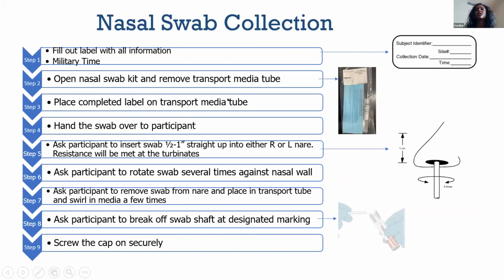Okay, the nasal swab collection. The participant will be collecting this themselves, so you're just giving them instructions on how to do this. First, these are the kits that are provided by ARUP, with the tube inside that has a little bit of media, and there's a swab in here as well.